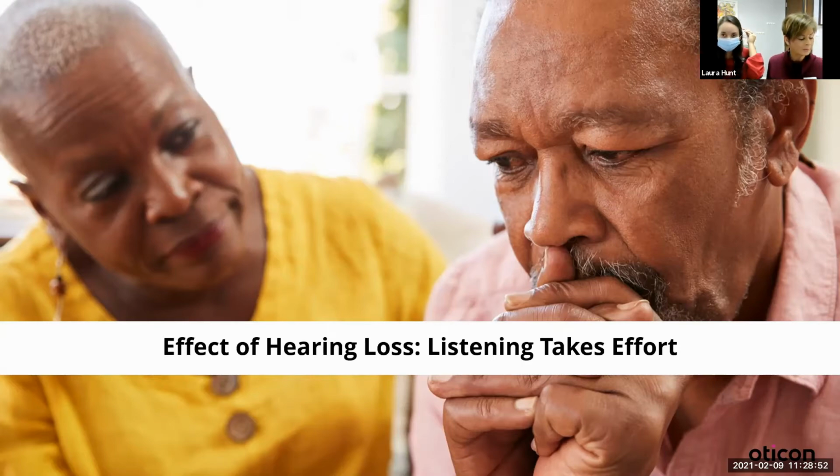We give a clip free to each person who is a patient. If you are part of this group, you can come into the office and we'll give you one free. You can see here as Laura is demonstrating, I'm going to have her turn around, it's pulling the mask low. So this is one thing that just physically is less effort for you because the mask is sitting low, it doesn't pull the hearing aid off.